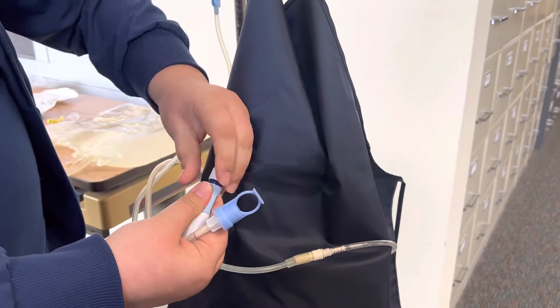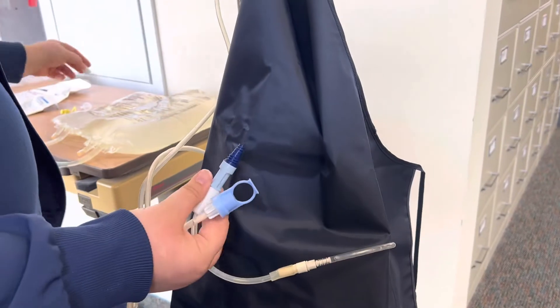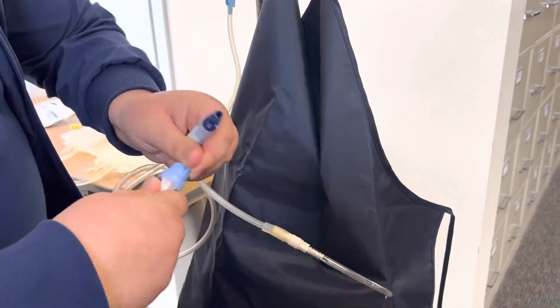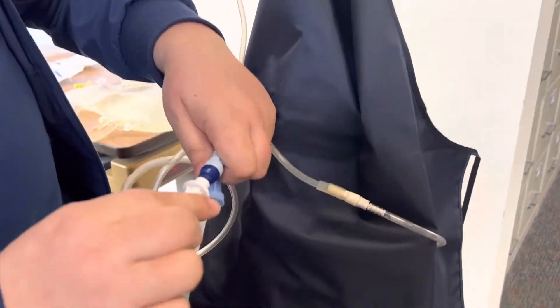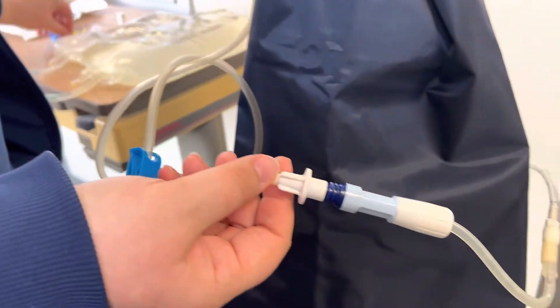You're going to remove the iodine cap — we're no longer going to use this one — and we're going to take the cap off of the remainder of the tubing and make the connection, of course wearing sterile gloves at this time.